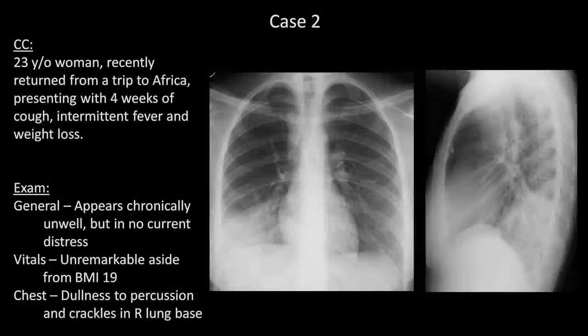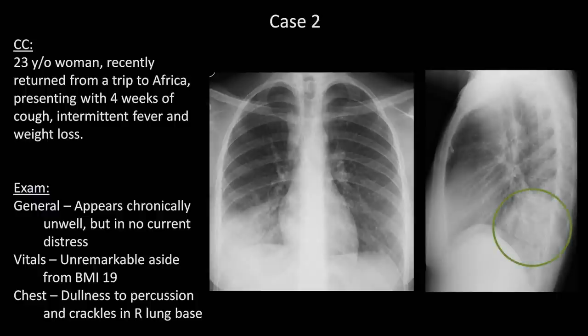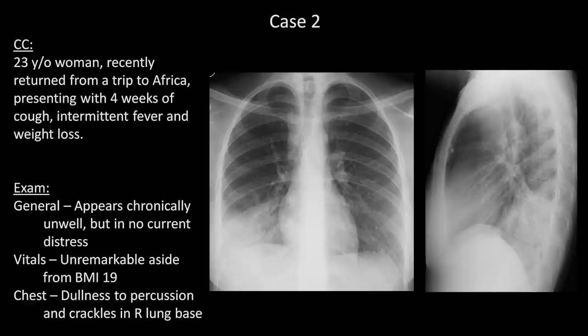Case 2. A 23-year-old woman, recently returned from a trip to Africa, presents with 4 weeks of cough, intermittent fever, and weight loss. The first thing you probably noticed was the dense opacification of the right lower lung field on the PA film. Examining the lateral film, we see that the patient has an opacity in the inferior posterior part of the lung, thus in the right lower lobe. This is a great example of the spine sign, in which there is an interruption in the normal progression to increasing lucency as one moves inferiorly down the spine on the lateral film. In addition, this opacity is well defined and dense enough to be referred to as a consolidation. On the PA film, you may be able to make out an air bronchogram.